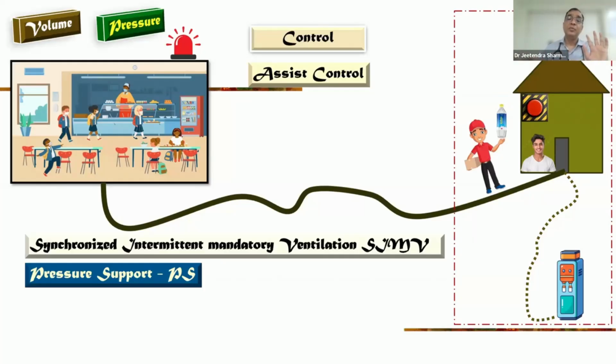Modes we understood. We actually understood the 7 modes. How come 7? Pressure control and volume control, 2; volume assist control and pressure assist control, 4 modes; SIMV volume preset and SIMV pressure preset, 5 and 6; and pressure support, 7. And you can combine SIMV with pressure support also, so whenever you take a spontaneous breath, it can be converted. Now I'm talking about the triggering mechanism.